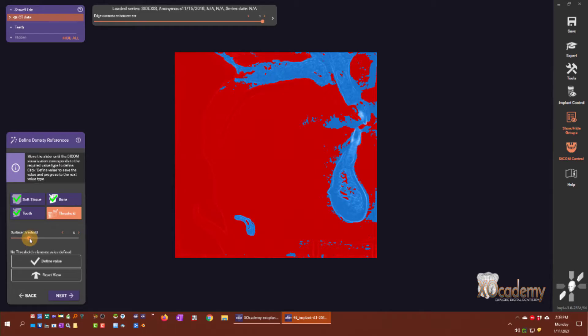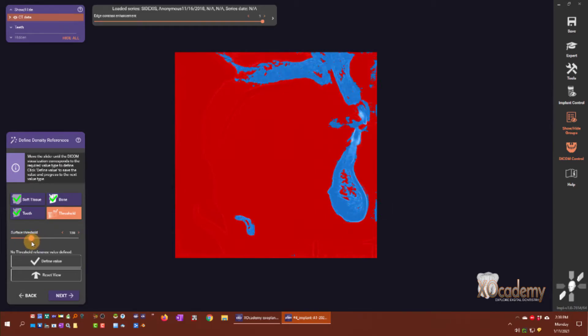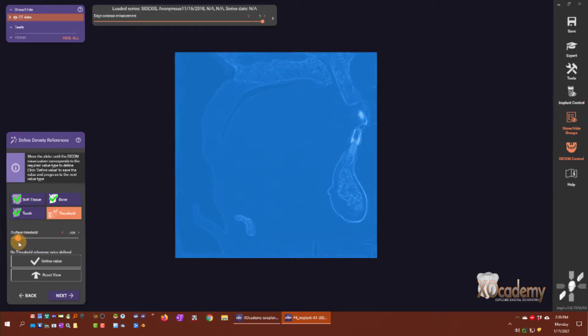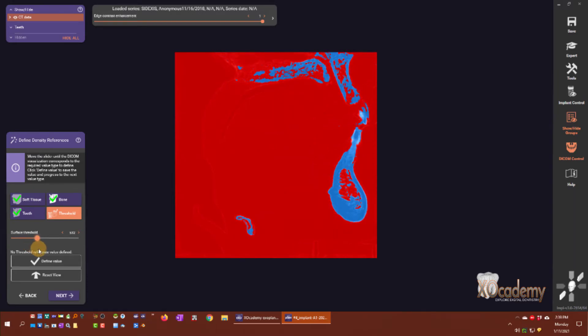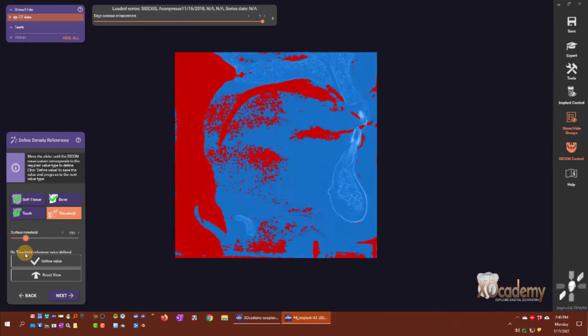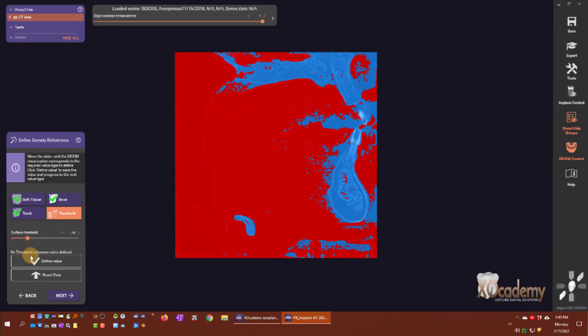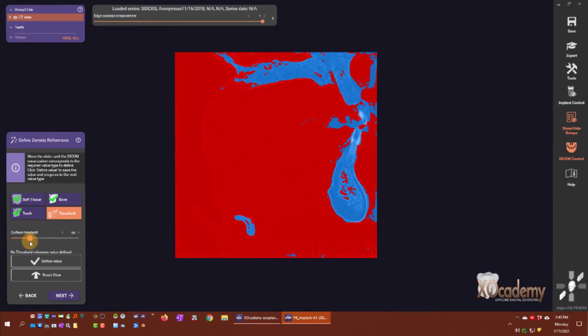This final step is the threshold. This is where you want the cortical plate to be outlined with nothing else in blue. This will help us define what is in bone and out of bone.